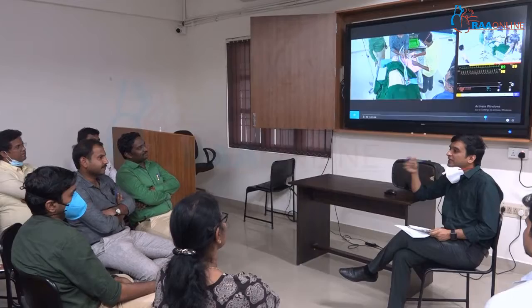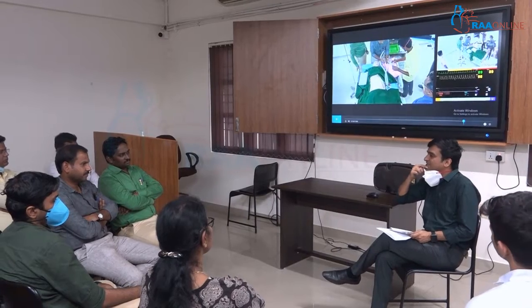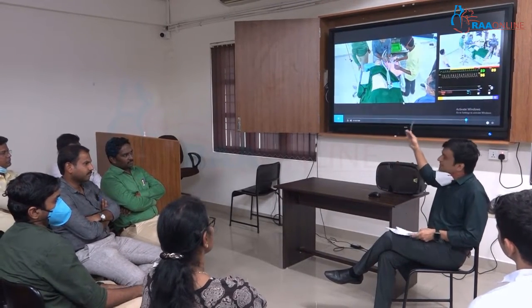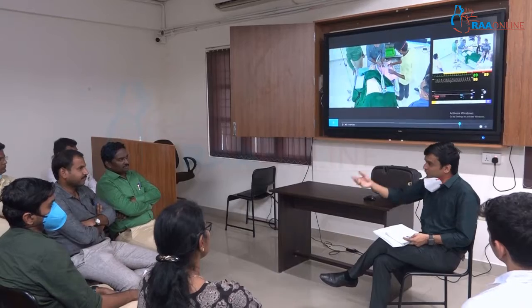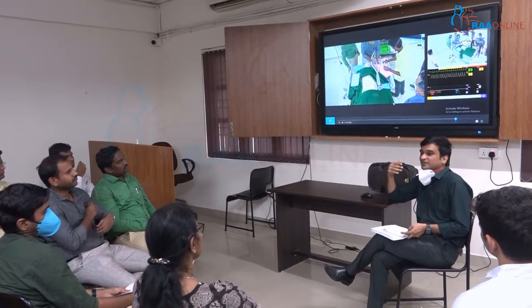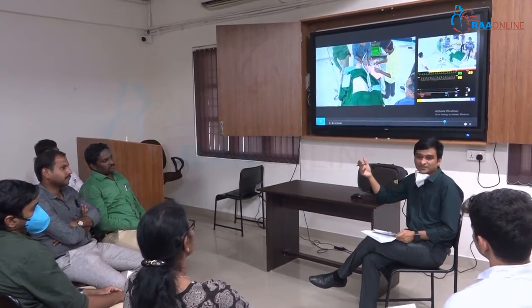So before we keep a mask over the patient, we have to ensure that the oxygen is on and the circuits are in the right place, before we oxygenate the patient, right? In fact, we didn't want to continue with that part, so we just assumed that. But you had corrected it when you took over the ventilation. So some of the parts we do by reflex, is it not so? Switching on the oxygen is a very important part, right?